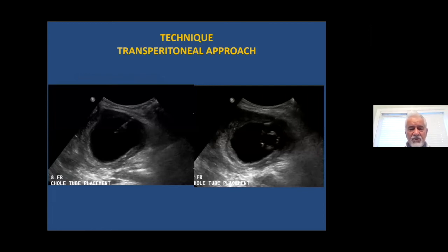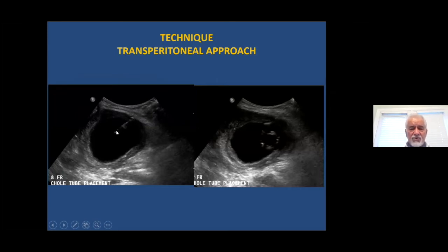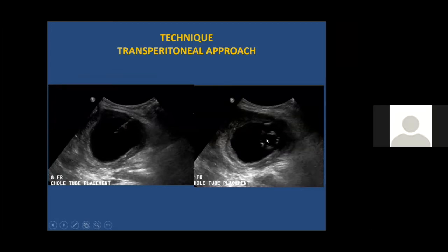Here is the transperitoneal approach without transhepatic access — a dilated gallbladder right next to the anterior abdominal wall. Under real-time ultrasound control, you can see the catheter going into the gallbladder using the trocar technique, and a loop has been formed in the gallbladder.